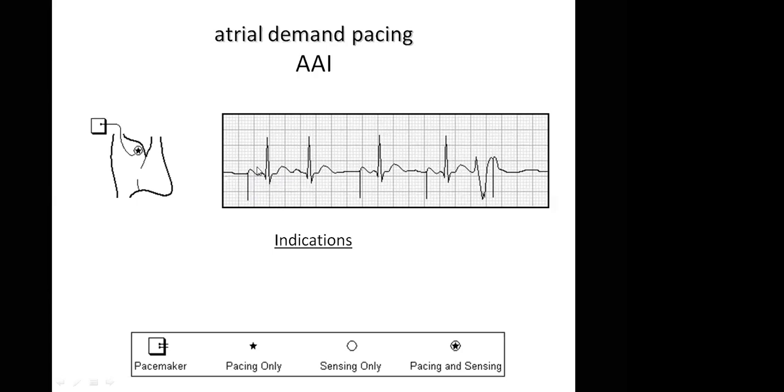Okay, just wait. So let's look at the duration. Two small boxes. Does it look like this duration? Does it look like this height? Yes. Look at this. Yes. Does it look like this? Does it look like this height? Yes. But we don't know exactly like that.